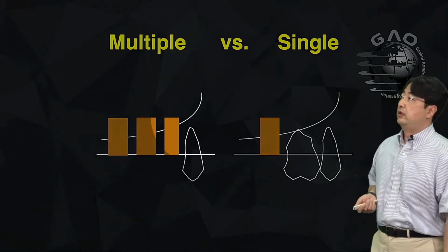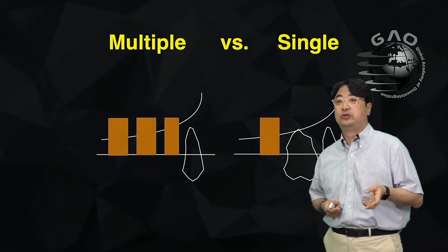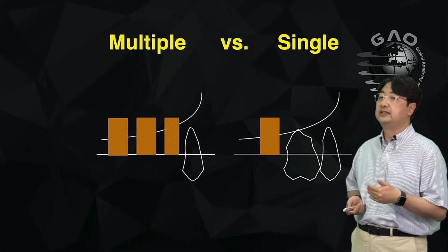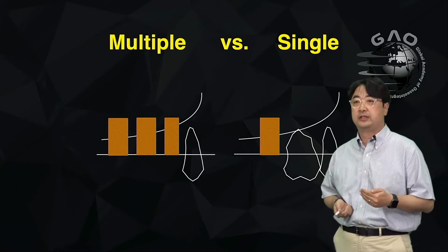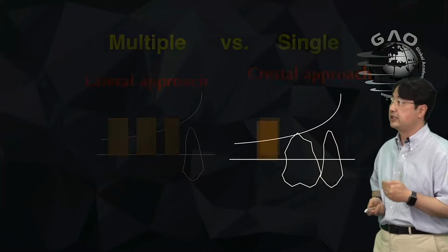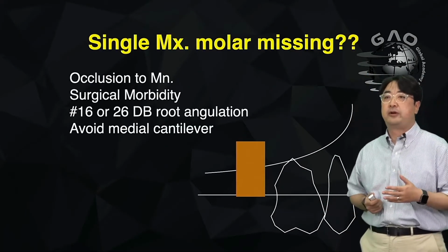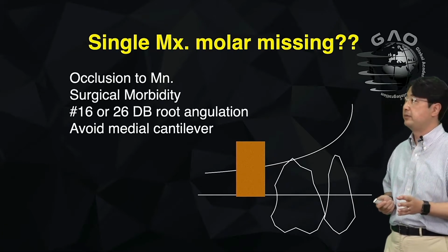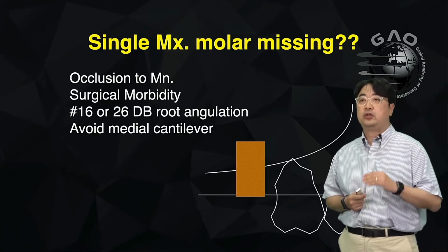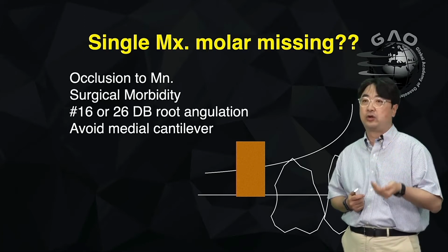When I do multiple implants, I'll do the lateral approach, then the crestal approach. If I have to do a single implant, I think about the crestal approach first before I do anything. This is the strategy that I have. For a single last maxillary posterior missing tooth, I always look at the lower first to see if we need the tooth, then I'm going to go for the implant.